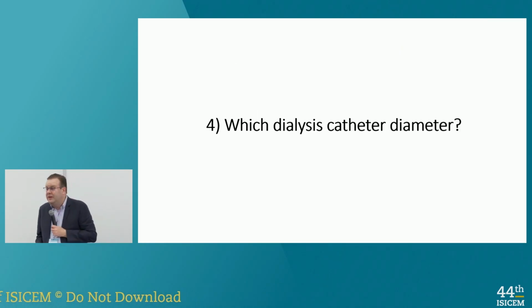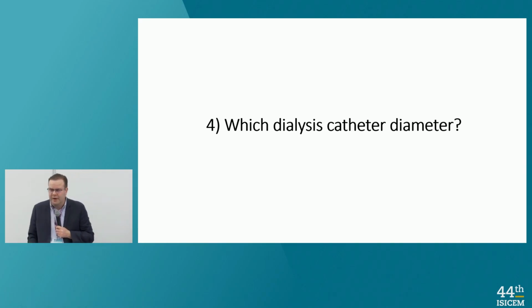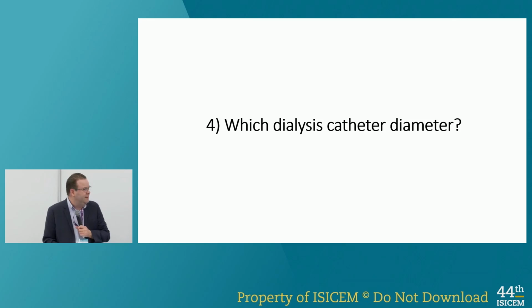Which diameter? Do you put 13 French, 14 French, 15 French? How do you do in your unit? You have to think about it. You have to know the size of your diameter. Of course, we said before that the higher the size of the diameter is, the better your blood flow can be, right?